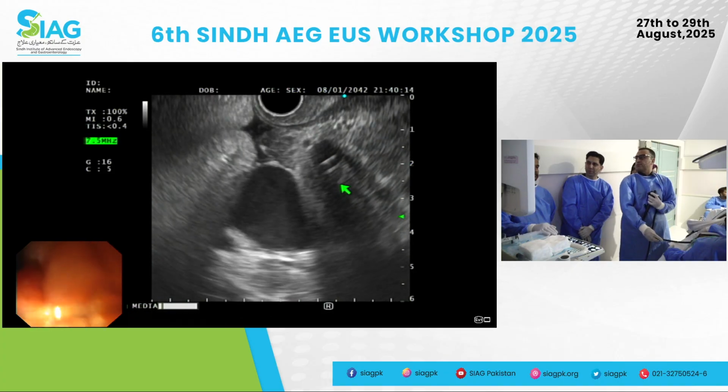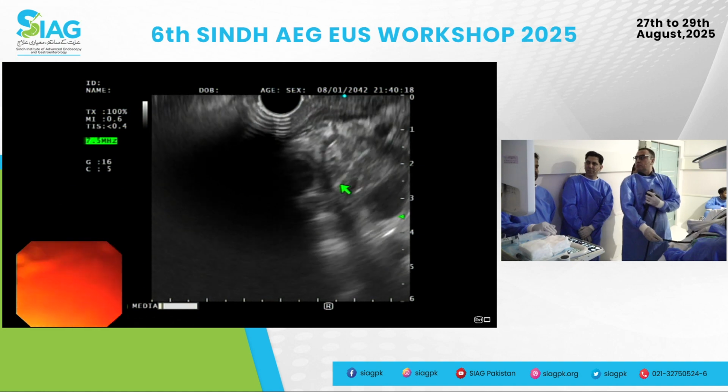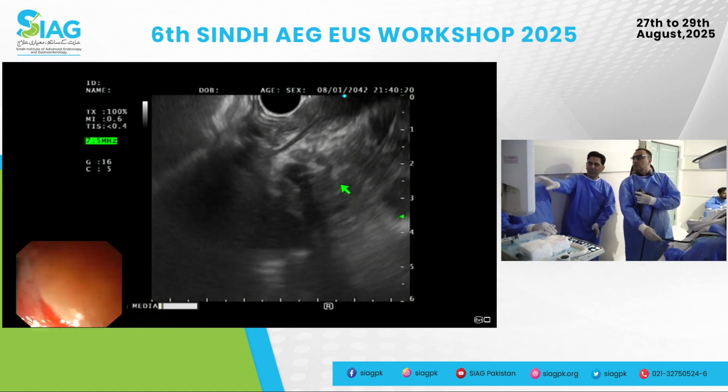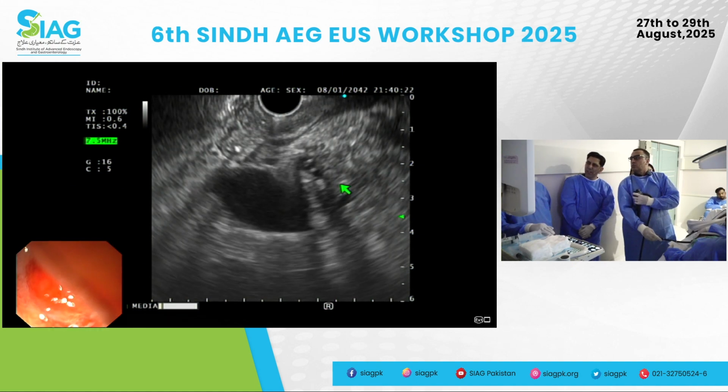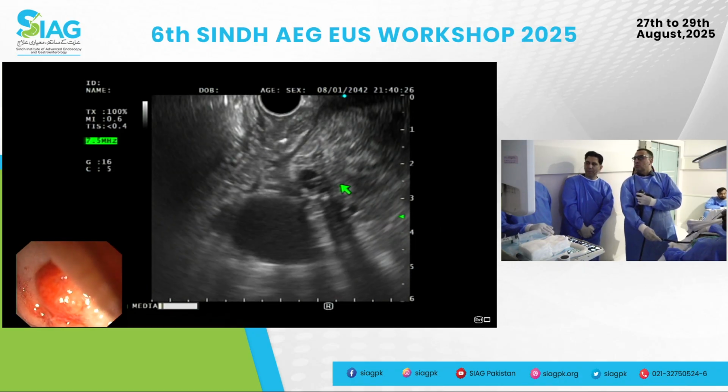Maybe the patient is already anesthetized, so we can actually suction, change the scope and put the ERCP scope in, and confirm what we have seen. So we'll be moving away from you, Nadeem. Thank you so much. Yes, sir.